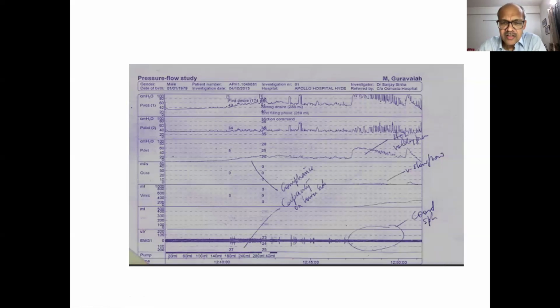Sphincteric EMG, which you're seeing in all these records, is rather unreliable. So these days we have switched completely to using video in all these patients, and we would see on a video.